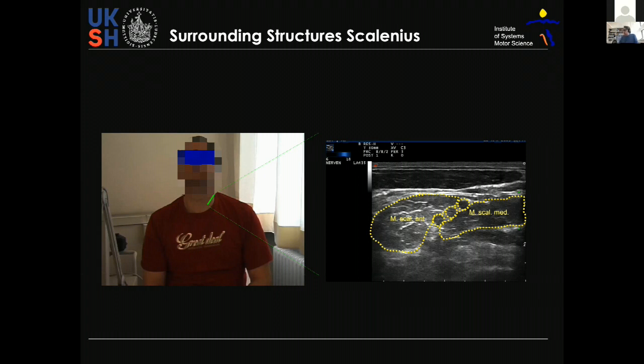If you are speaking with different people doing botulinum toxin treatment or looking at how they perform, you see that there are a lot of different approaches of where to inject, how deep. In my experience, swallowing problems are due to injecting not in the sternocleidomastoid but too deep. If you go very much to the mastoid and inject maybe 1.5 centimeters deep, you can reach the venter posterior of the digastricus muscle. Or if you go down, then the infrahyoid muscles. So I think it's very important to inject superficially enough and to avoid injecting too deep.